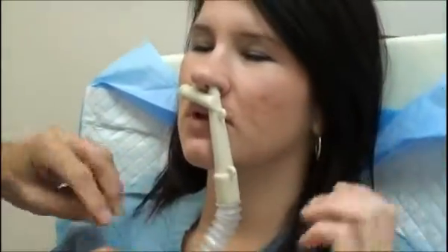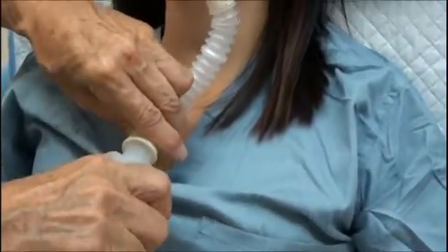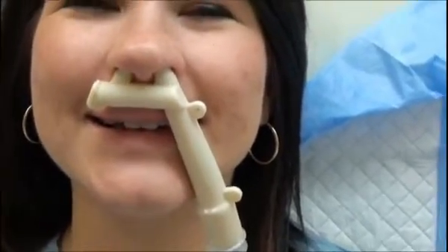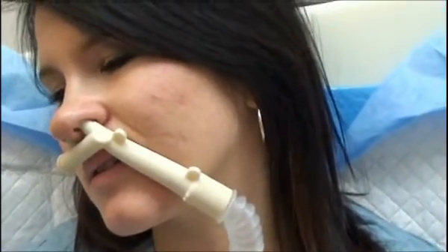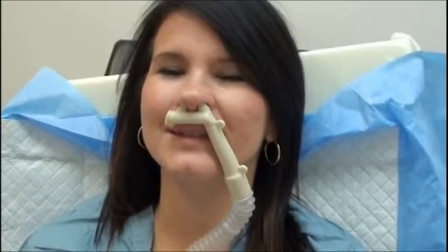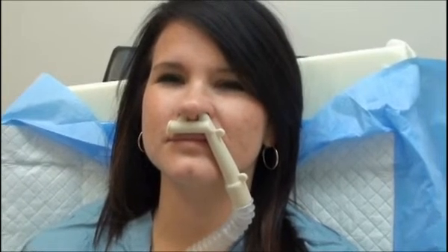I'll expand the corrugated tubing. And for a facelift, I'll hook it up and tape it down to the lady's chest. When you get to be about 60, you'll want a facelift, and that's what this is designed for. Turn your head to the left all the way. Turn your head to the right all the way — you can see how the thing stays in place. The surgeon, if he has to, can move it around a little bit. This is what it was invented for: airway management during facelift surgery under deep sedation, light general anesthesia. It's a wonderful thing.